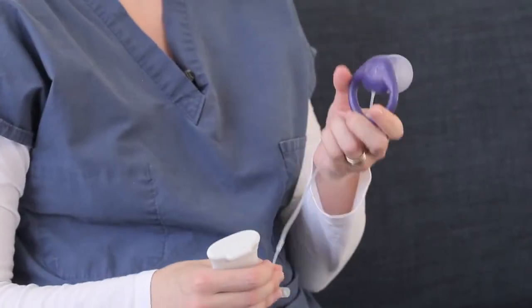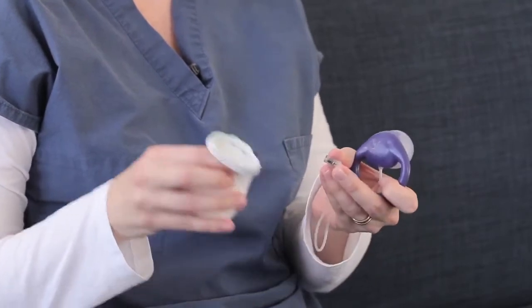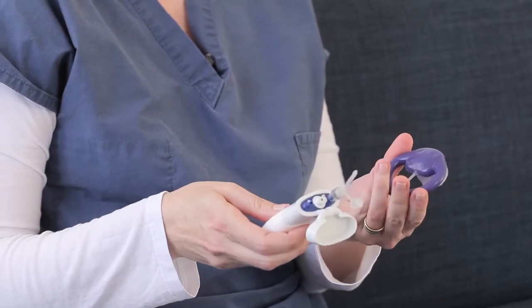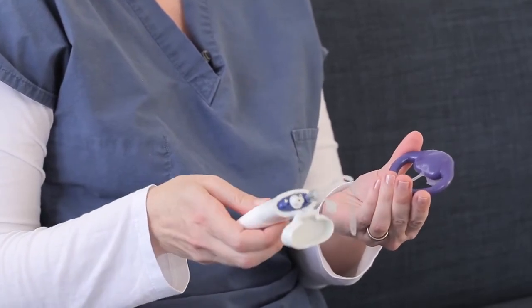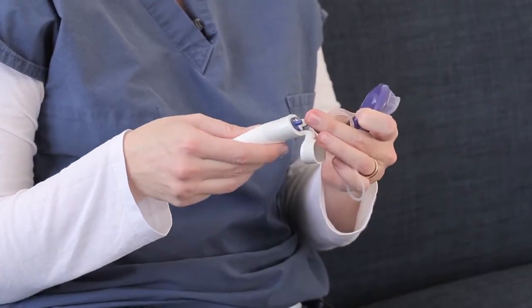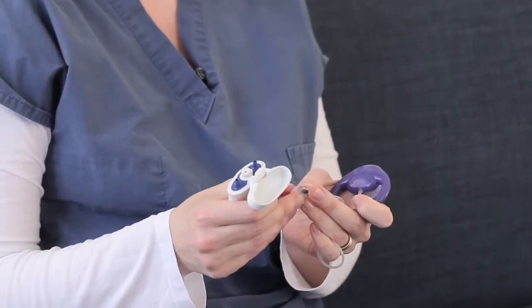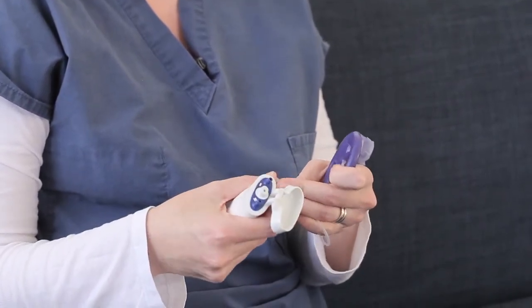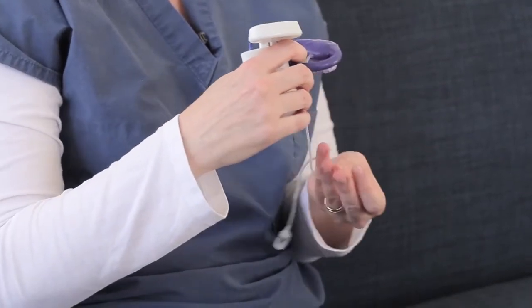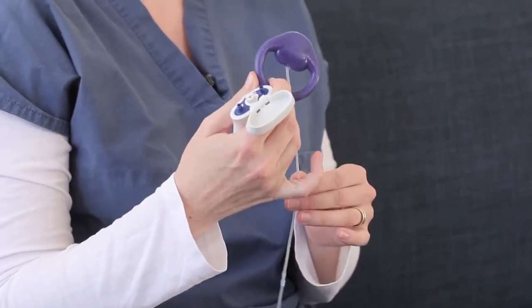To remove the insert, you first need to deflate the balloon. So you attach the minus port of the pump to the valve and pump it a couple times until the pump becomes concave. Remember, when you're detaching the pump from the valve, not to pull on the tube, just hold it onto the valve so that you don't damage the insert. Once it's deflated, you're going to hook your finger around the base and simply pull it out. Do not pull on the tube, as you might damage the insert.